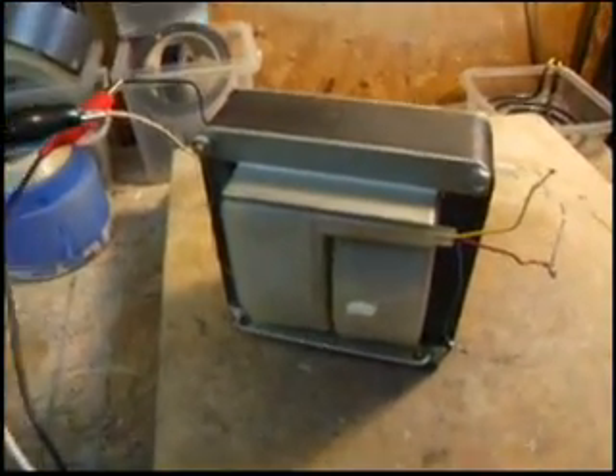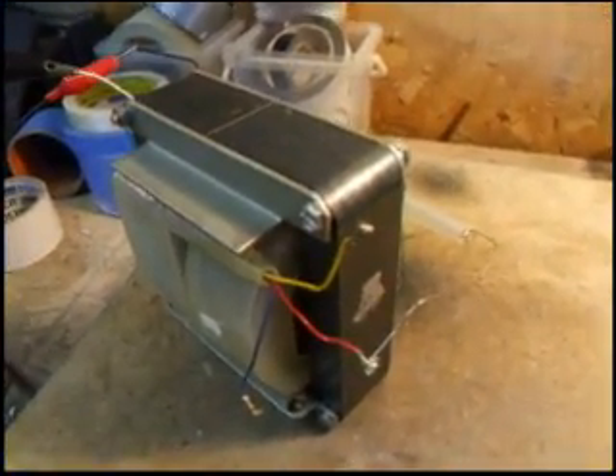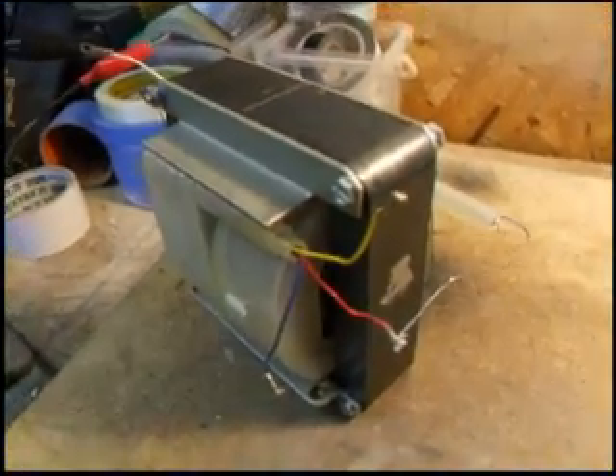This is a 70kV high voltage transformer which was removed from a dental tube head. The transformer has two secondaries, 35 kilovolts each.